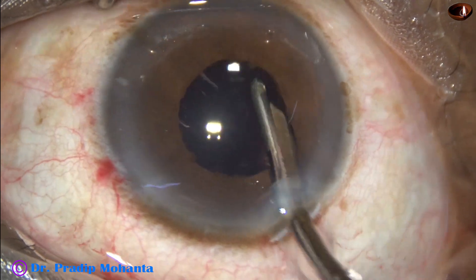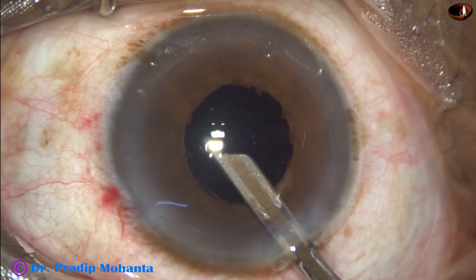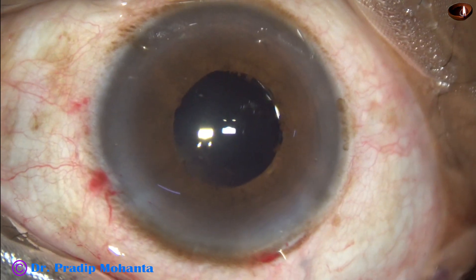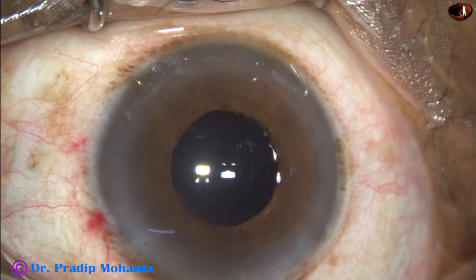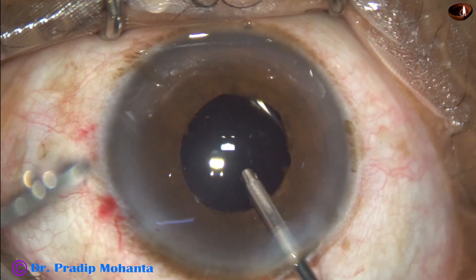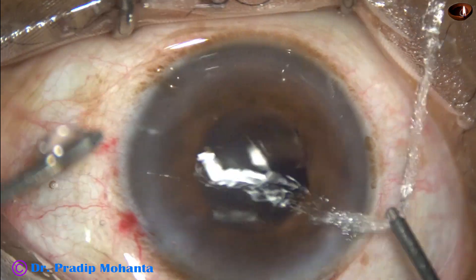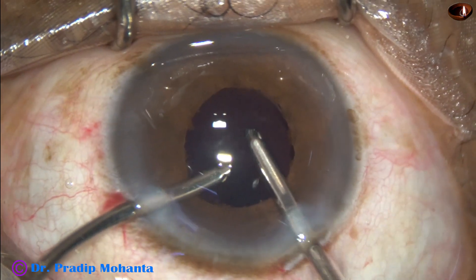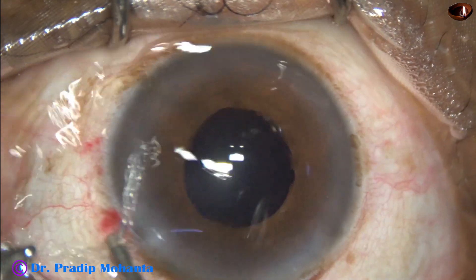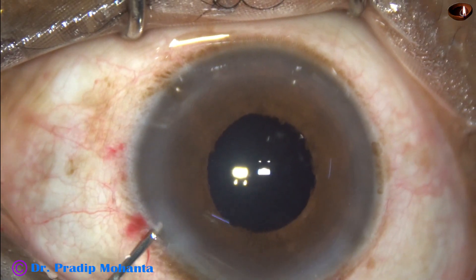Visco from the capsular bag as well as the anterior chamber is removed with the 23-gauge Simcoe. Some cortex was also removed from the 5:30 o'clock position. Now I go behind the intraocular lens again and irrigate the capsular bag. Irrigation and aspiration is performed to remove all the viscoelastic substance that has been used. This much time should always be devoted to removal of visco.